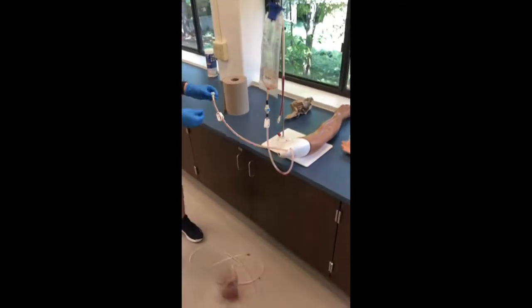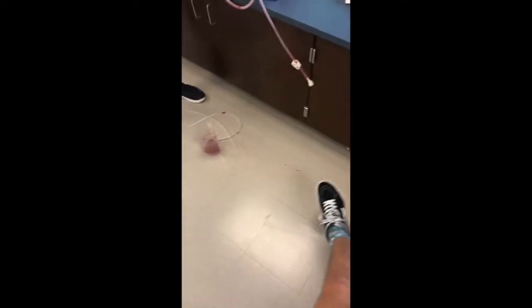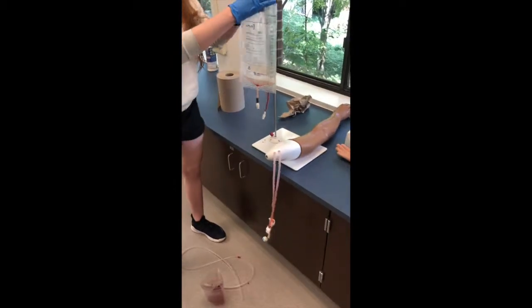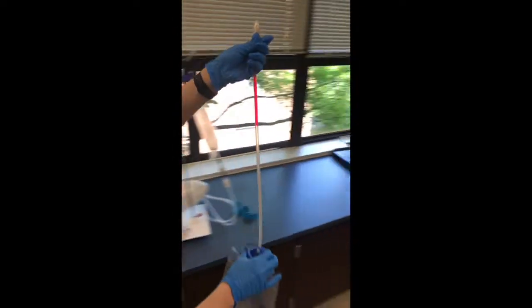Once you're finished with that, you can disconnect the adapter tube. It's okay if accidents happen — Sydney just spilled blood everywhere, but it's fine. After you disconnect from the adapter tube and disconnect it from the bag, you're going to take the blood bag over to the sink.